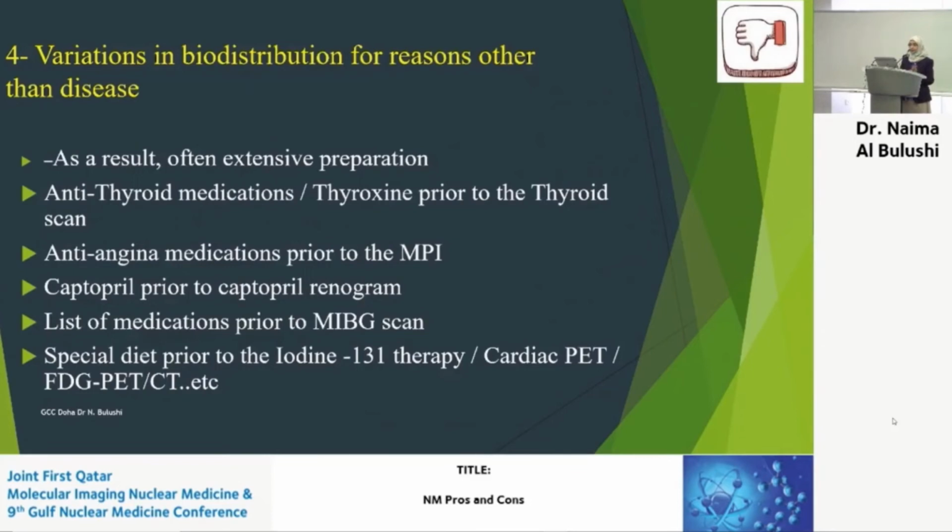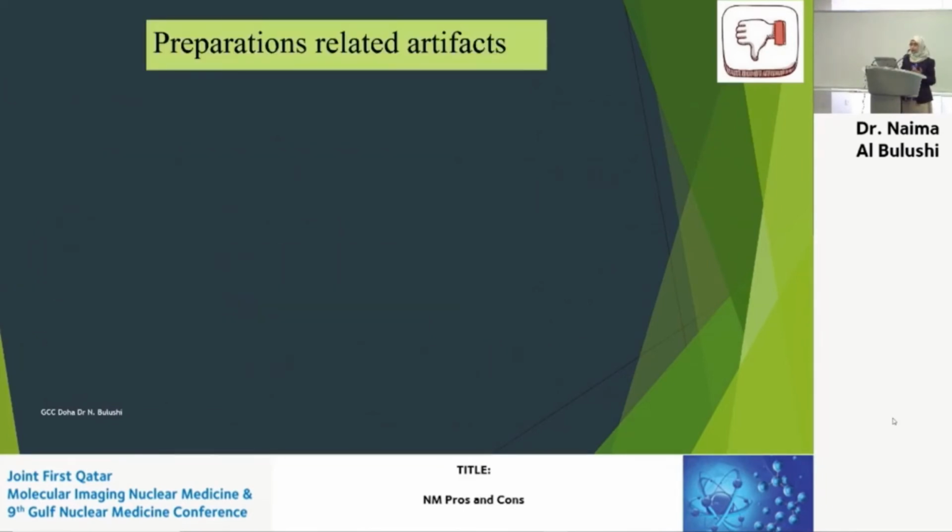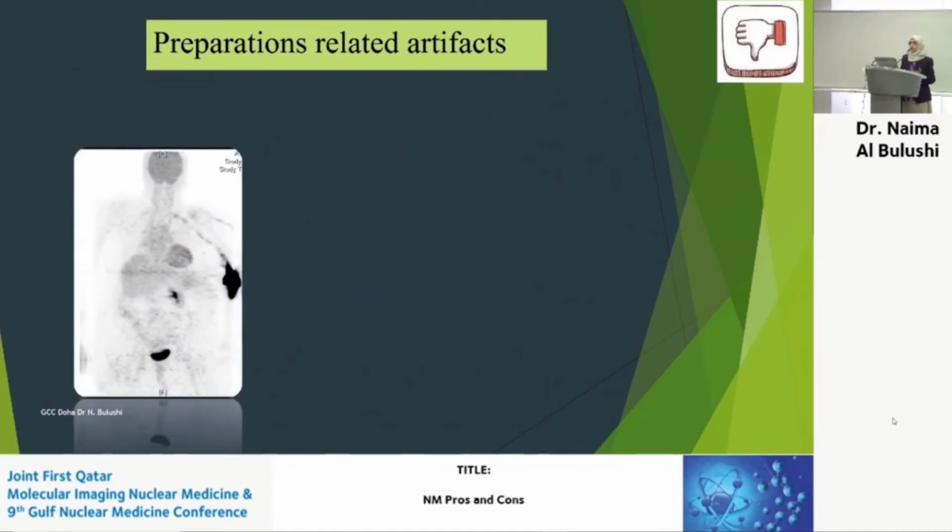A very special and lots of preparations, that we had a video, we had leaflets that we printed, for prior to iodine-131 therapy and diagnosis. Cardiac PET needs a lot of preparation. FDG PET in general needs a lot of preparation. I'll show you some of the artifacts. So this is one of the preparations for the artifacts.